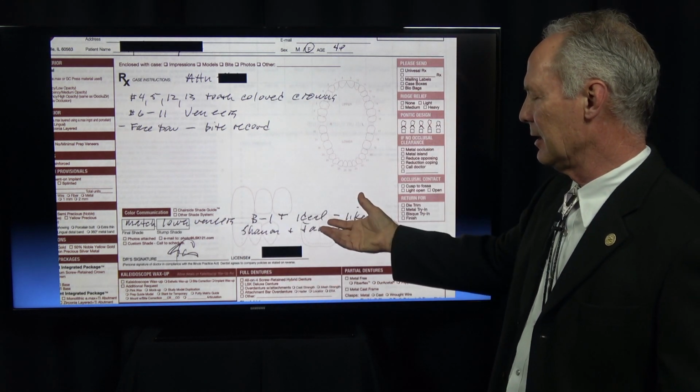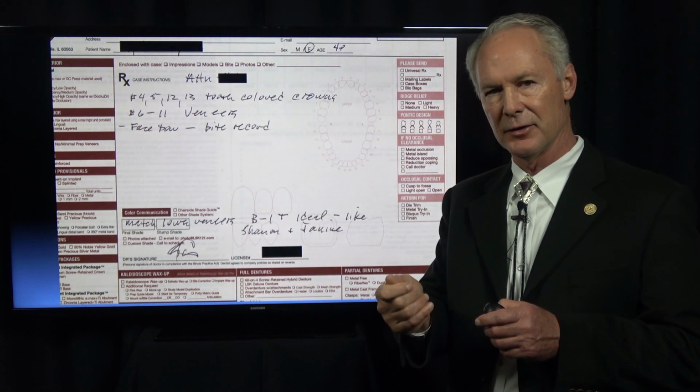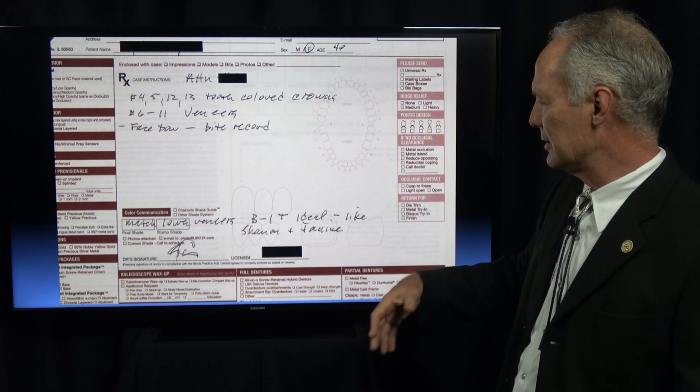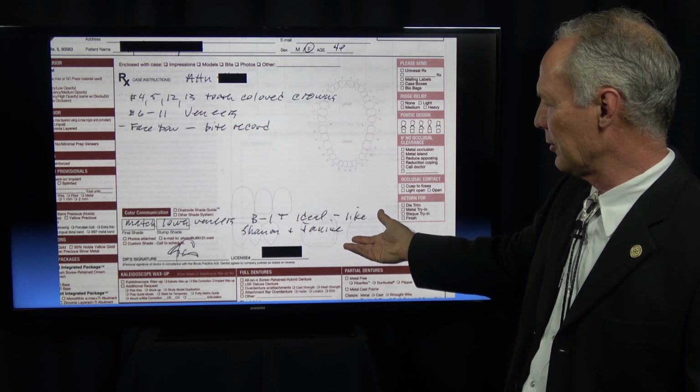That's why we're sending photographs with a diagnostic camera that's very accurate. You don't want to send a cell phone shot. You want a very accurate high-end camera to take the photographs so that it's as if the patient were sitting in the laboratory with the laboratory technician.